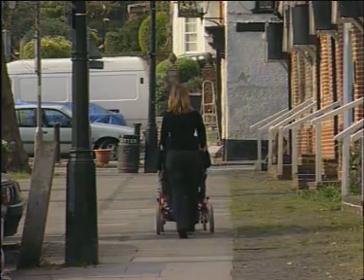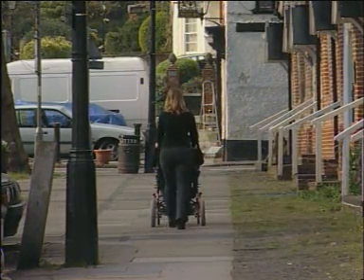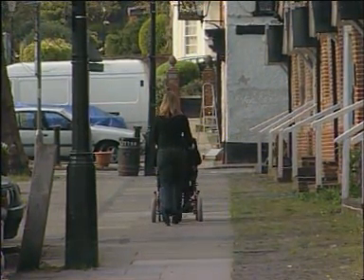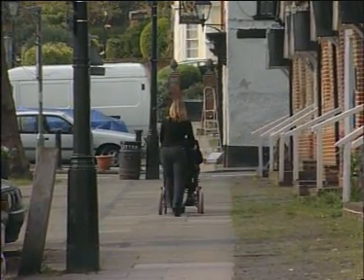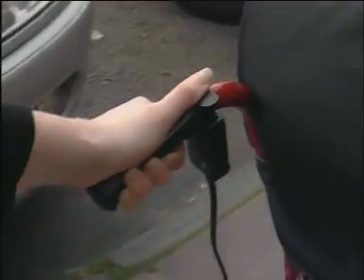The wheelchair drive unit, or WDU for short, is newly launched in the UK in spring 2002 and shortly on world markets. It costs £299 in the UK — around a tenth of the cost of a conventional powered wheelchair. The WDU is the latest brainchild of Sir Clive Sinclair, for many Britain's most famous inventor, and his research team at Sinclair Research.